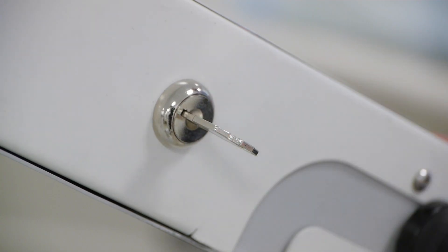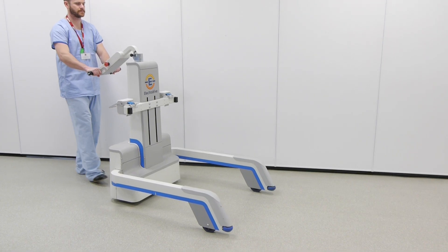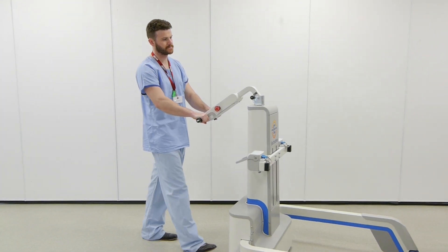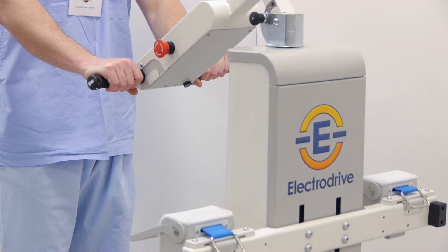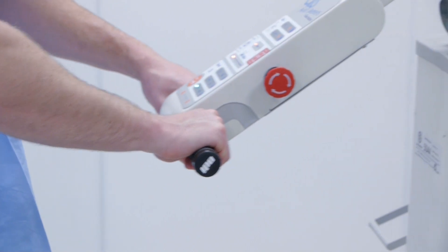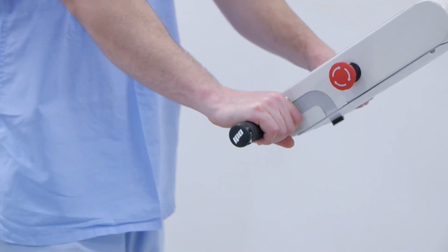Turn the key clockwise and the Gezunda comes to life. The handles are where you steer or control the Gezunda's speed. The right grip is the throttle. Rotate the grip forward and the Gezunda moves forward. Rotate the grip back towards you and the Gezunda moves in reverse.